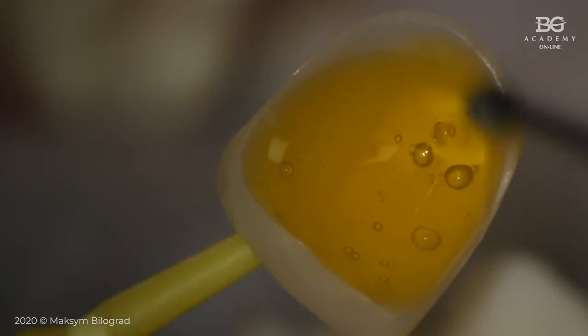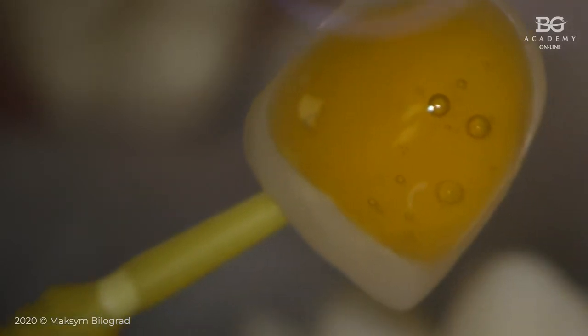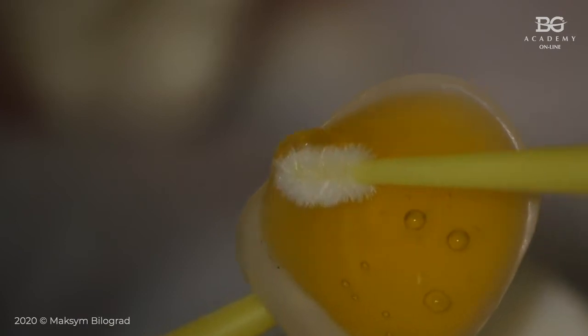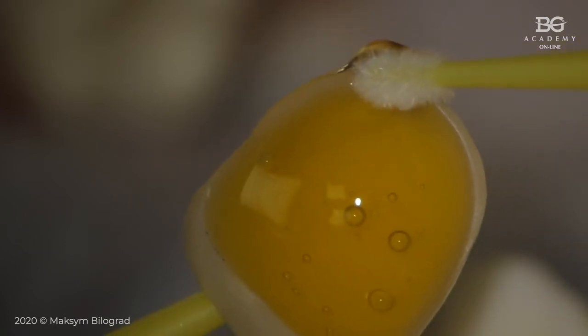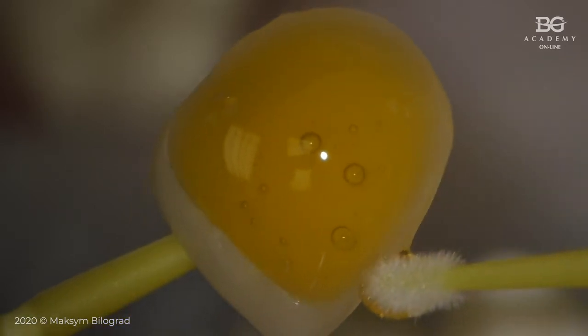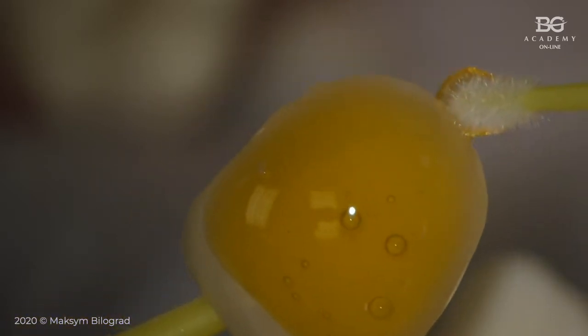Wow. Okay, let's put some hydrofluoric acid, and then what is also very important is to move your hydrofluoric acid. See, exactly, I'm showing you with high magnification. I'm moving hydrofluoric acid to the periphery.